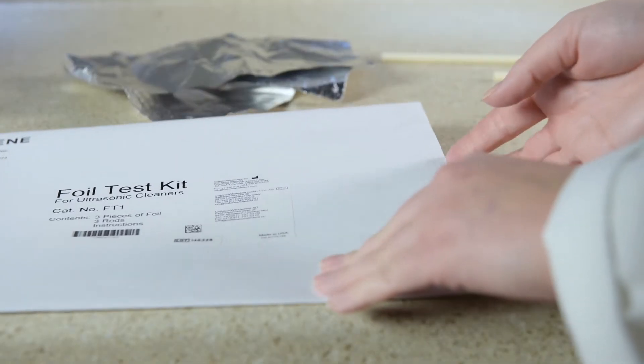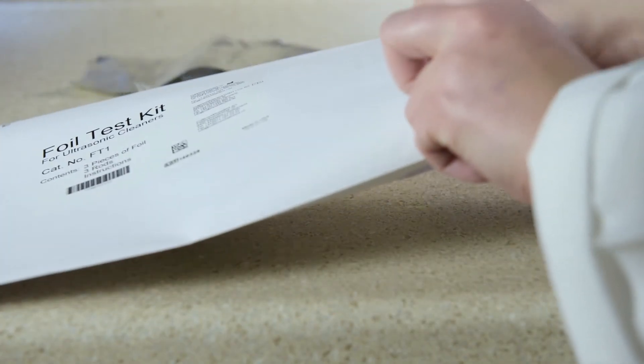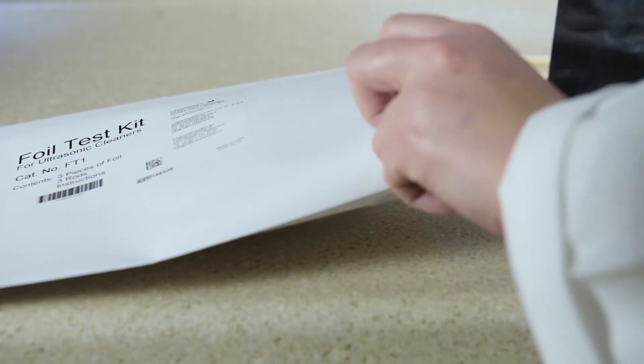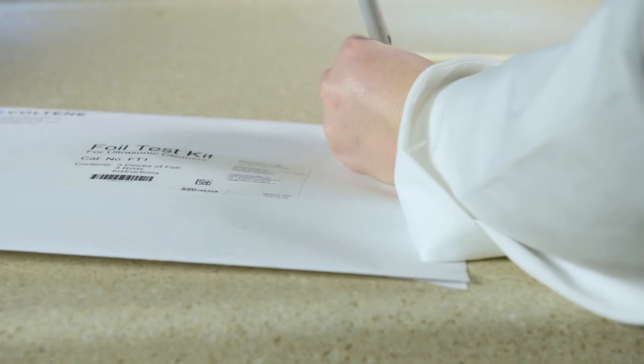After your evaluation, date and pack the foil test strips in your envelope. Save these strips for future test comparisons on your UC150 to see how your unit is performing over time.